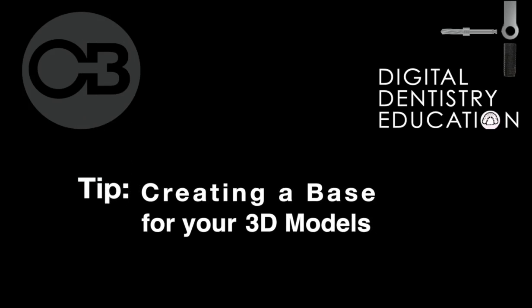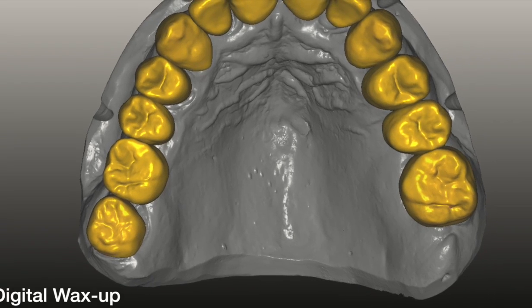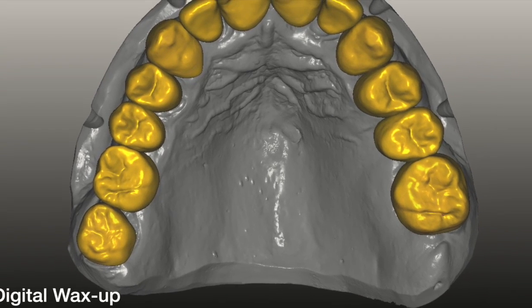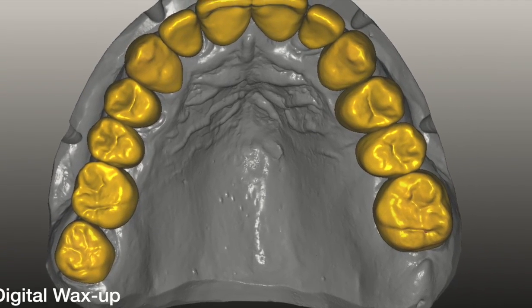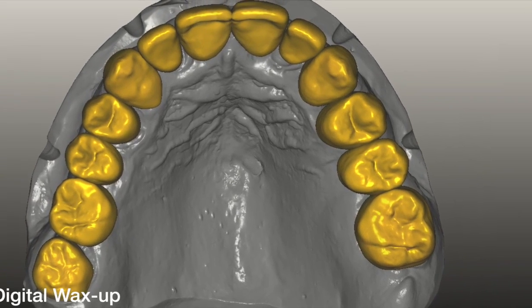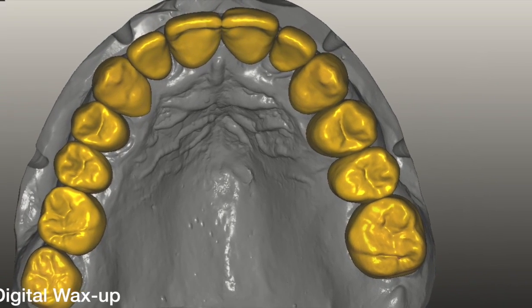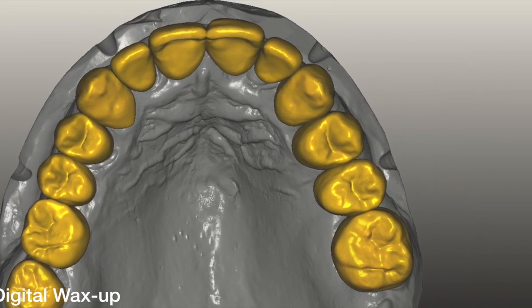Hi, this is Dr. Christian Brenes. Some doctors have been asking me for a simple and quick way to create a base for their 3D models for 3D printing, after they have created a digital wax-up or if you just want to make a physical model.